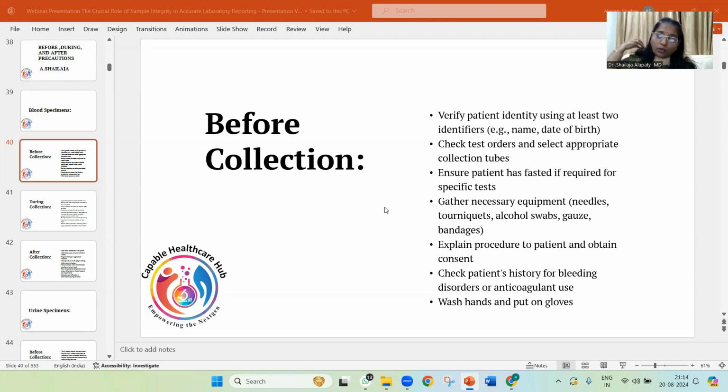And one more good point that you brought up, sir. If they're sending it through the chute system, the moment the sample is collected, please ask them not to send it in the chute system. Wait in the emergency department for 20 minutes, then send it in the chute, because if you collect it and send, because of the pressure, it gets hemolyzed. So if anybody is having a chute system, do not ask the emergency department to send the sample immediately. Let them keep it for 20 minutes and then send it, because by that time it will get clotted and then the hemolysis will not happen.